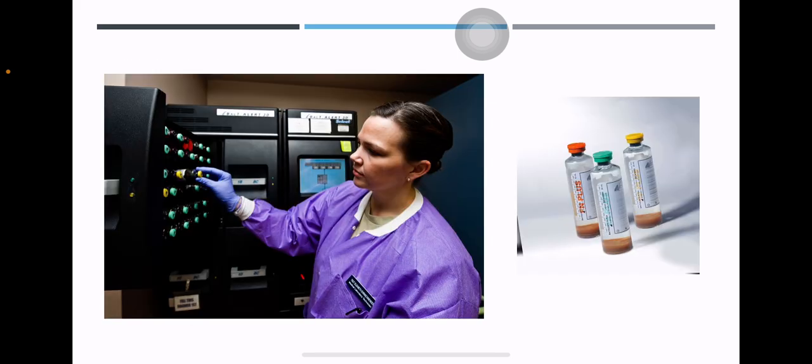So this is just a demonstration. She is going to remove a positive blood culture bottle because it is now yellow.